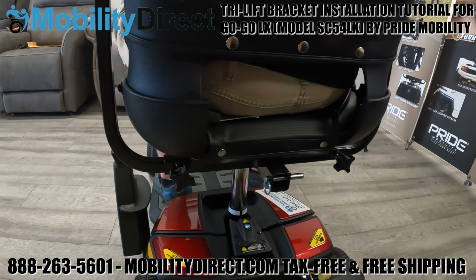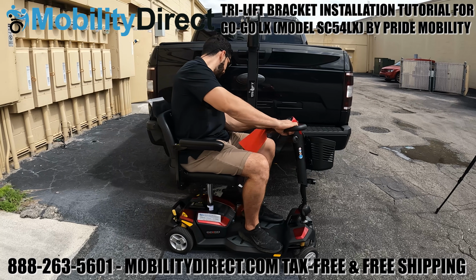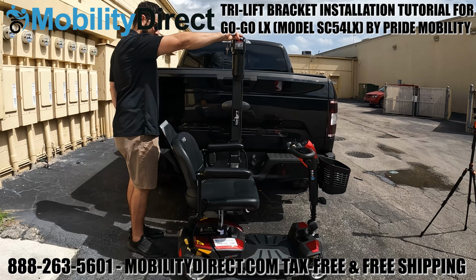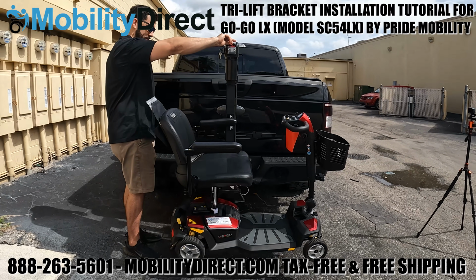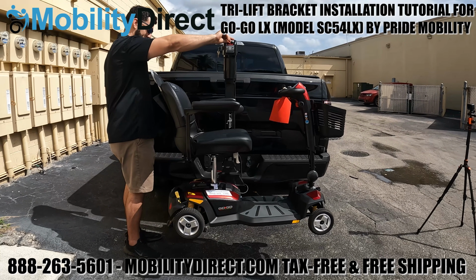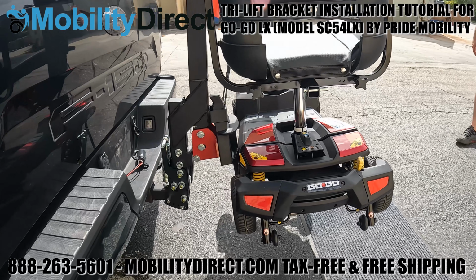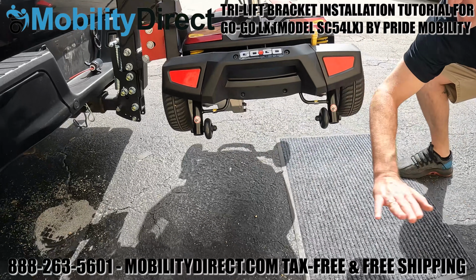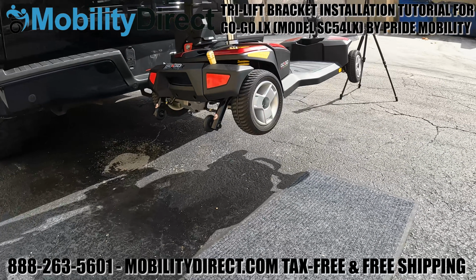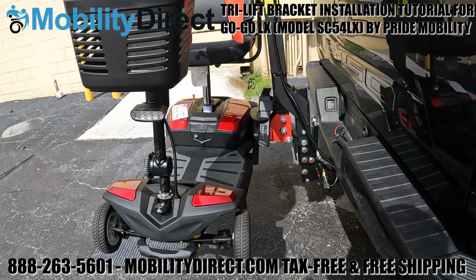And in order to use this scooter now with the tri-lift, you just need to ride the scooter right up to the red triangle that's on the base of the tri-lift so that it hooks right into that black triangle that's now attached to your scooter. That red triangle will hook into that black bracket, which is a triangle shape, and just lift it straight up. It's pretty impressive. It lifts it up far enough to where you don't have to worry about your tires on the scooter hitting anything. It gets it really high up there, and it's very, very sturdy, very secure.